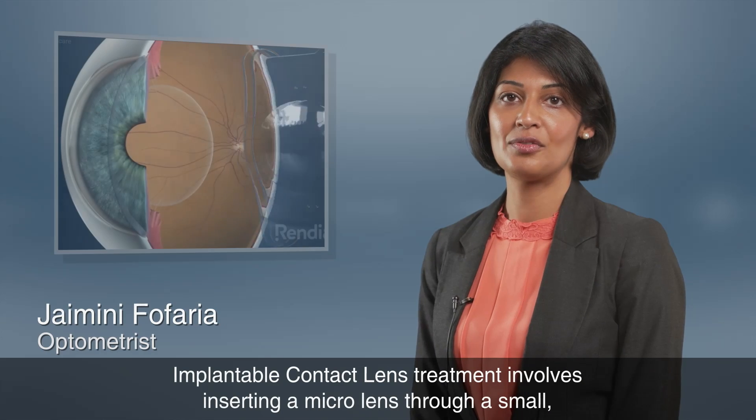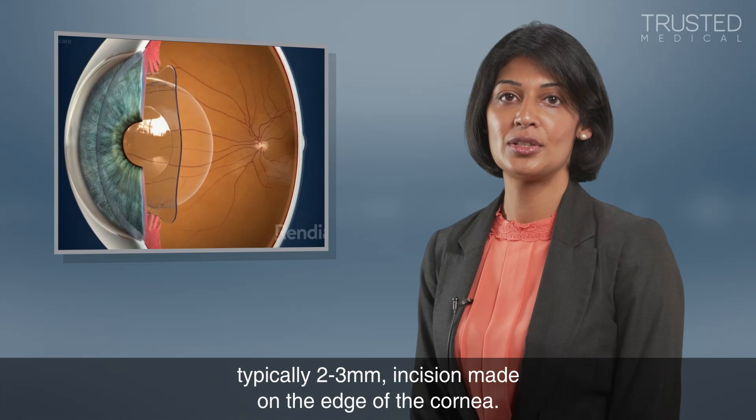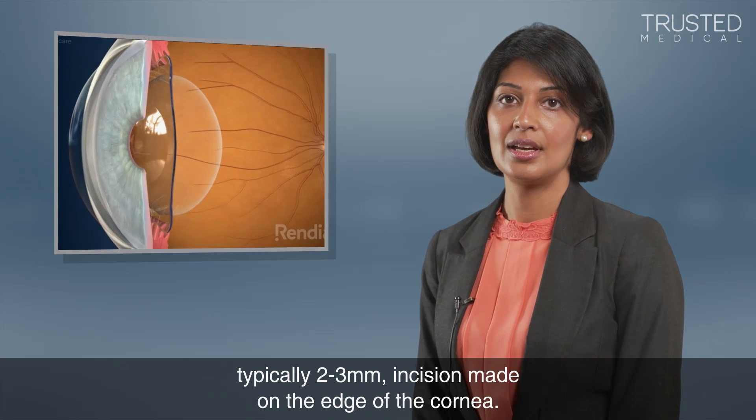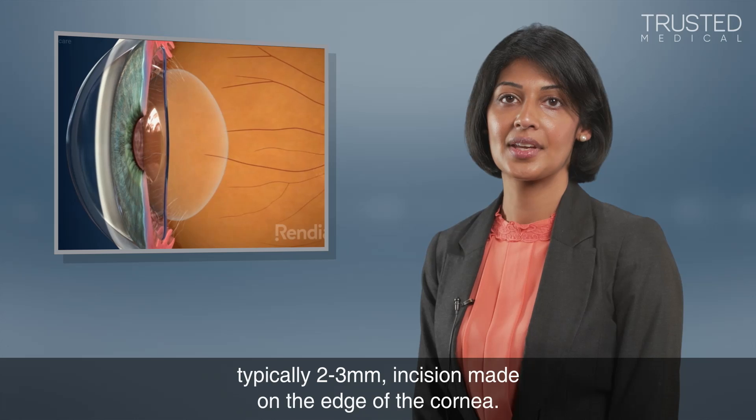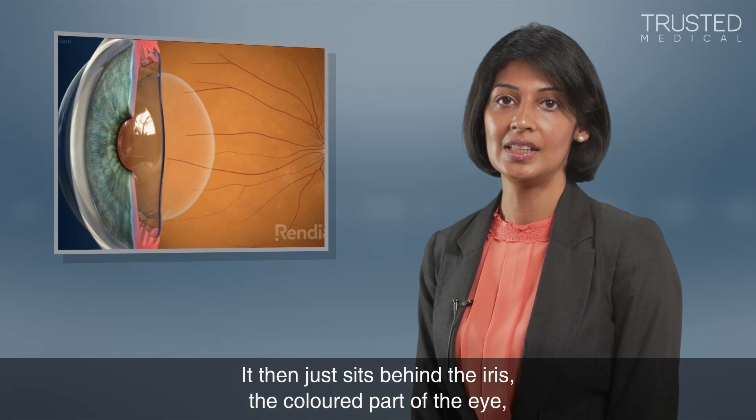Implantable contact lens treatment involves inserting a micro lens through a small, typically two to three millimeter incision made on the edge of the cornea. It then sits behind the iris, the colored part of the eye.